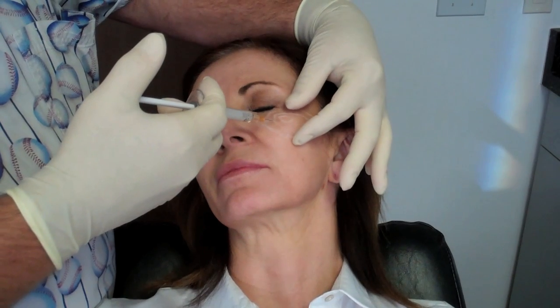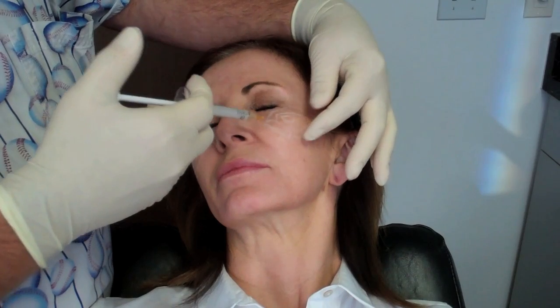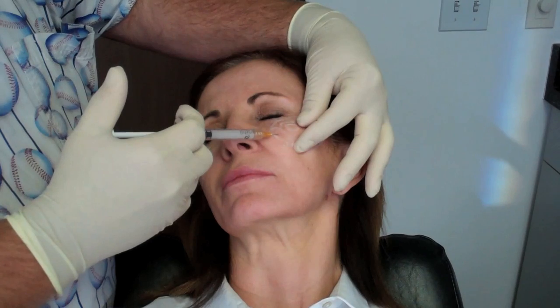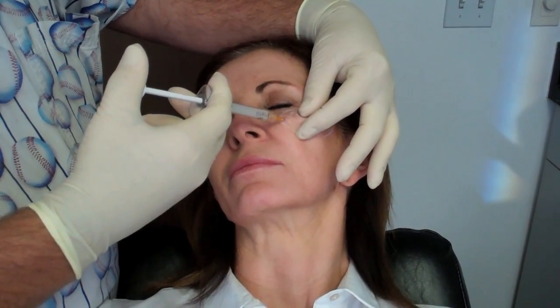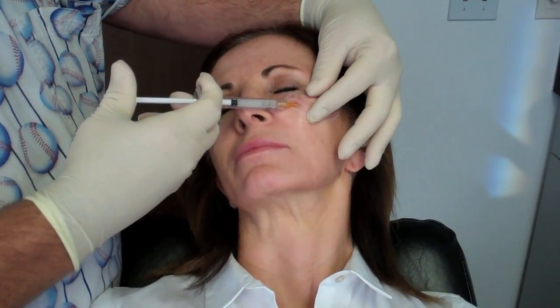Now I will fan it. I'll put a bunch right in here and then fan out from that, then put another injection back. First, I start by putting a layer right along the incision. I put a little saline in here so when I first go through, I inject that saline to get rid of any possible biofilms that could be in the Artifil — I don't want that to be included.